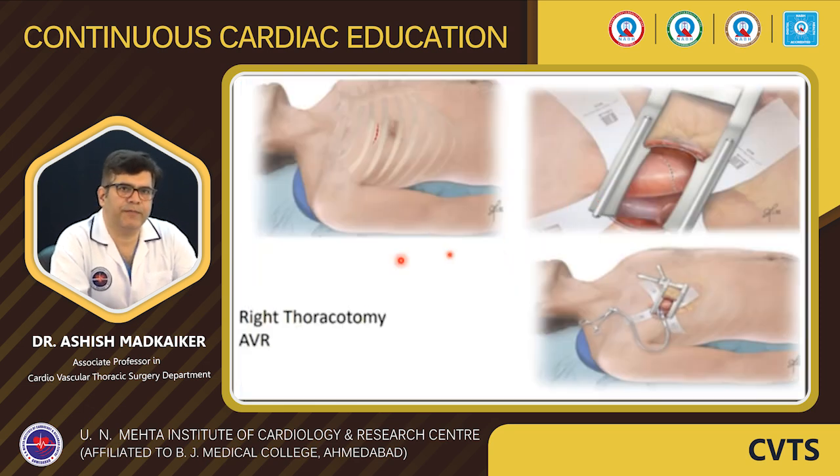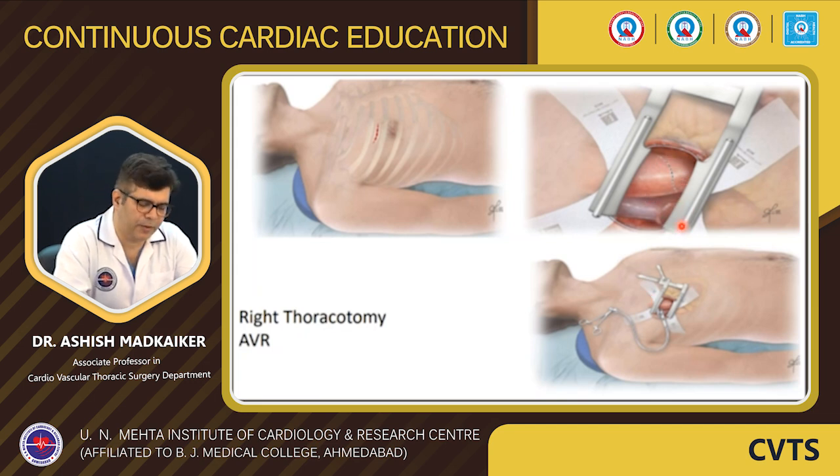So as a prototype, we'll just see how we do a right thoracotomy AVR. The skin incision is usually on the second intercostal space. We divide the skin, subcutaneous tissue, and then the muscle, and open the pleura, and then we apply the metal spreader, and then we take a good amount of pericardial stay stitches to bring the aorta under vision. This is followed by cross clamp and aortotomy.